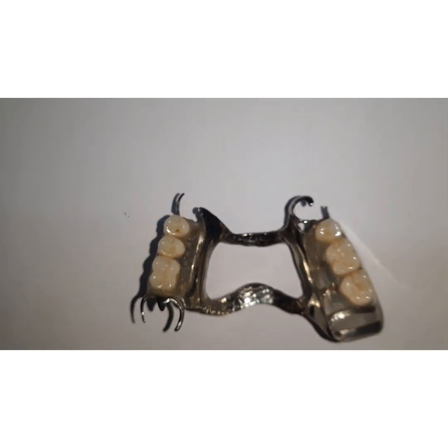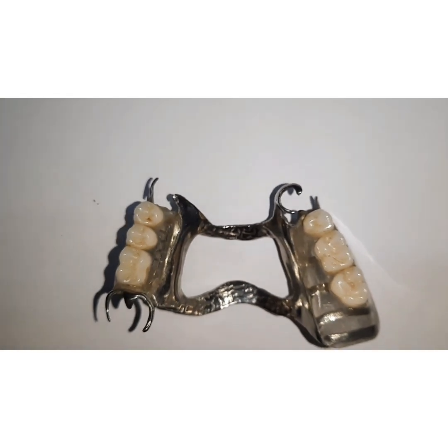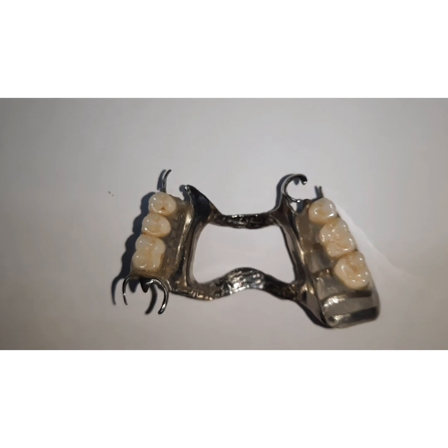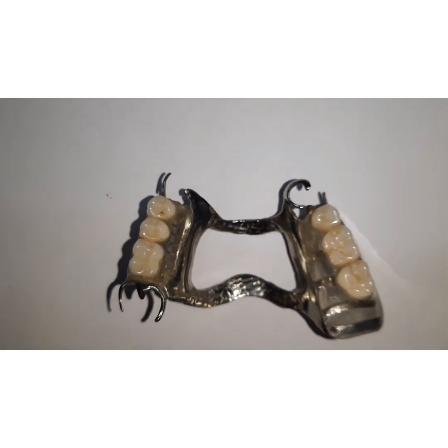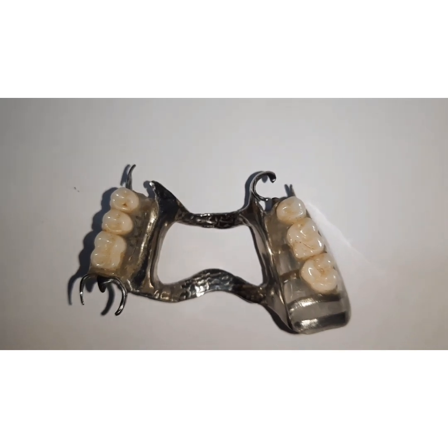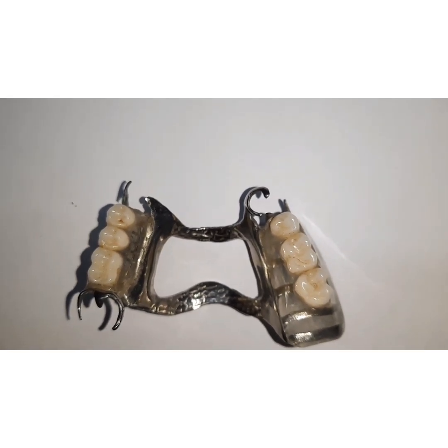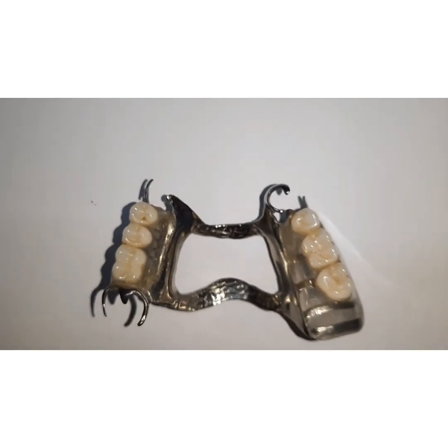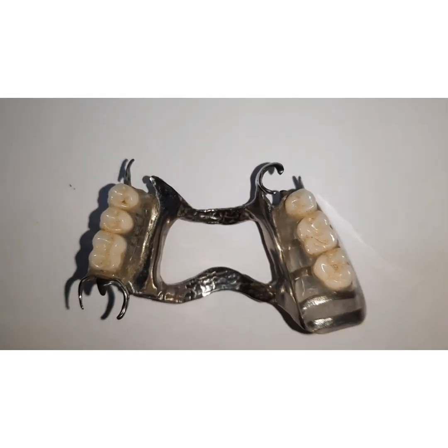so that you remove the interference between the teeth and the opposing teeth. And if the problem is mild, it can be corrected by grinding that cuspal region, that is the cuspal inclines, and if the problem is more, then in those cases you need to remove that particular tooth and reposition that tooth in a proper position.